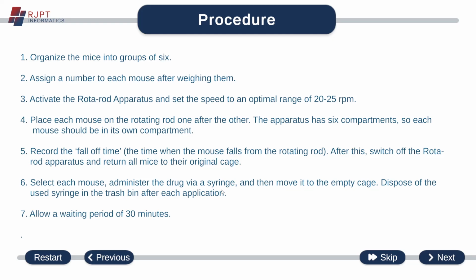Then, with the help of a syringe, we have to administer the diazepam drug. Then we have to allow a waiting period of 30 minutes. We have to wait for 30 minutes so that the drug could take its action.